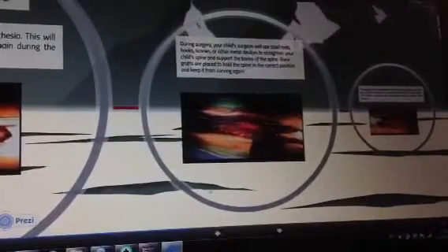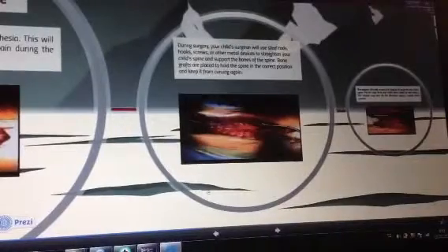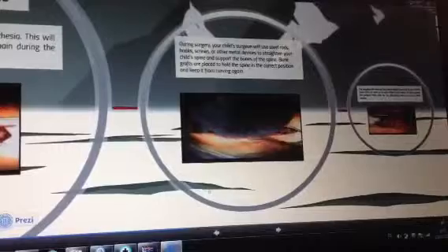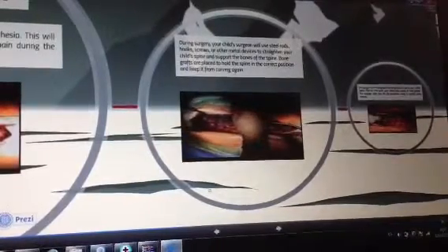Efficiency. So at the proximal and distal ends of the construct, I use a polyaxial screw, mobile in all directions, and at the intermediate segments, I use the uniplanar screws. Again, this enhances our ability to correct rotation.